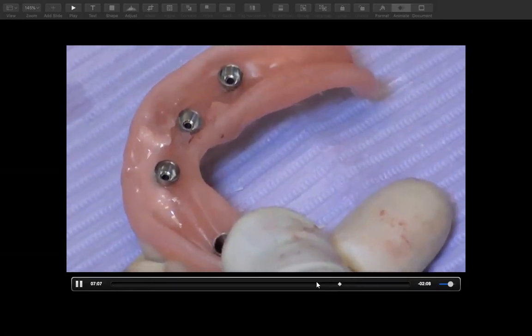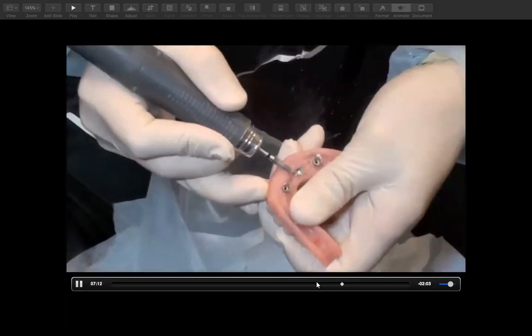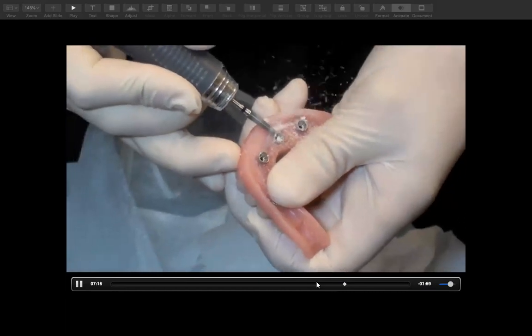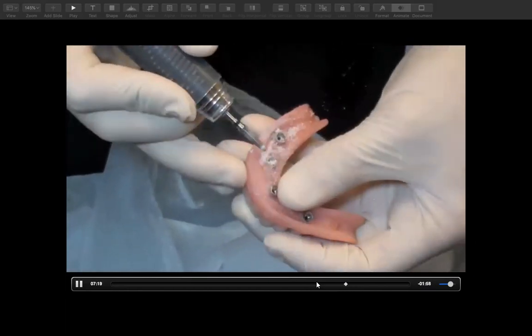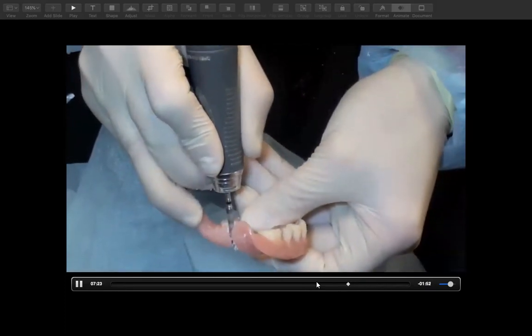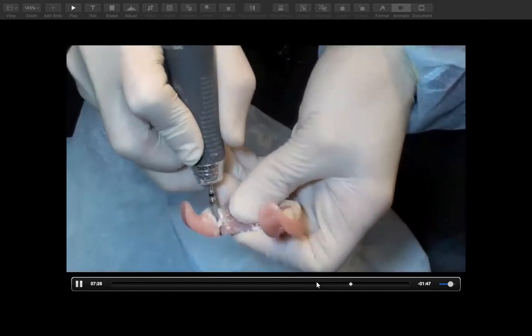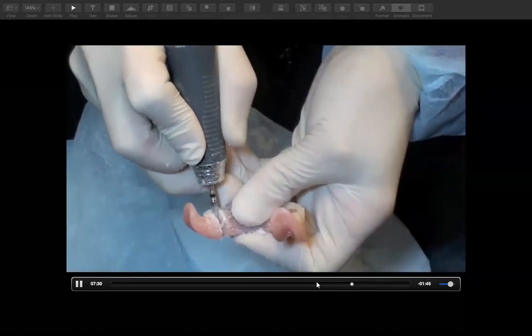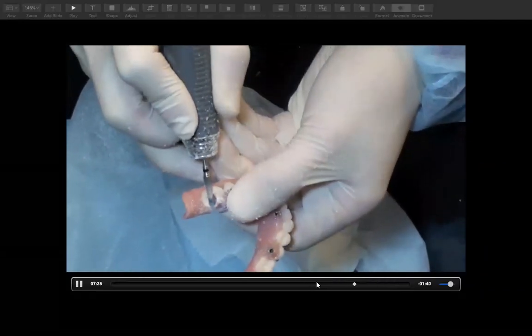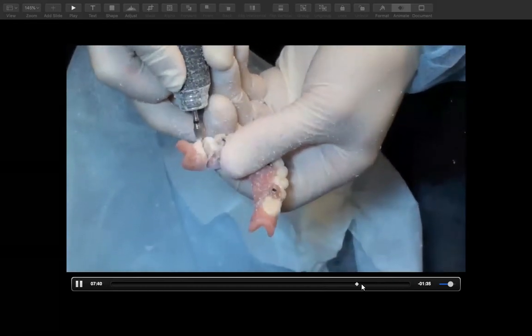What we're doing here is backfilling in with acrylic, and we want to fill in, we don't want a concavity, we want more of a convexity, and we want to make sure that those temporary copings are completely sealed with acrylic. Sometimes when you do a pickup, there can be an air bubble, a little void, but with that GC Trad, what's nice about it is it's a really fine powder, and it flows really nice once you wet your brush with monomer and pick it up. And it really seeps down in there. It works really well. I haven't had any issues with that.